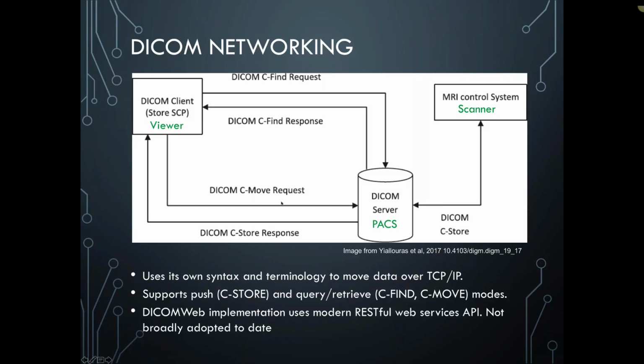So it's somewhat of a circuitous way of getting the images, instead of just saying, pull the image from the PACS to the viewer. You're instead saying, hey, will you push those images to me. So it's a little bit complicated and takes a little getting used to. When you're used to doing web-based kinds of communication, this can feel like a very weird and sort of tedious way of communicating. But those in the DICOM community have gotten pretty used to it.